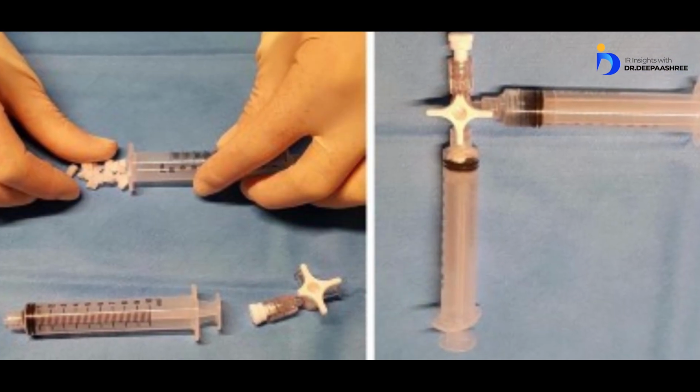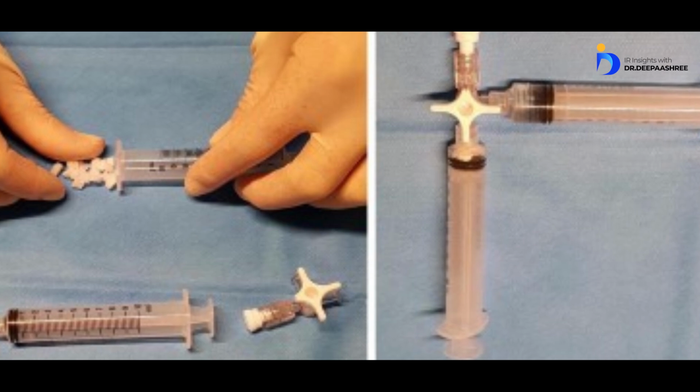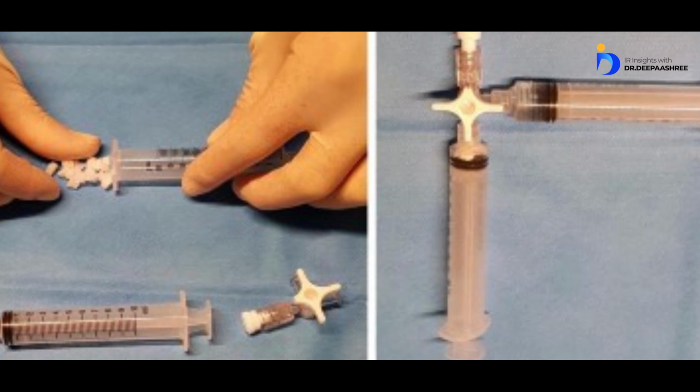Correct. Then, if they start doing this, they can go into various other embolization particles like PVA. Then they start using Lipiodol, gel foam, glue. They can use coils. They can use an Amplatzer vascular plug. And it goes on and on. But this is the first step to start on a daily basis. They should get the hang of making the gel foam into a nice paste. The preparation of the gel foam itself is an art. So as we go, maybe we will discuss more about it.